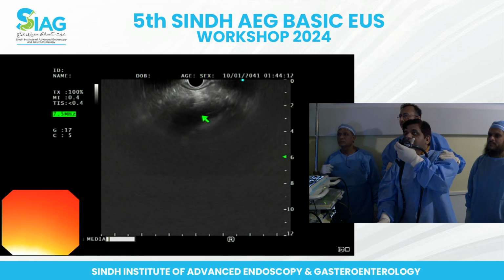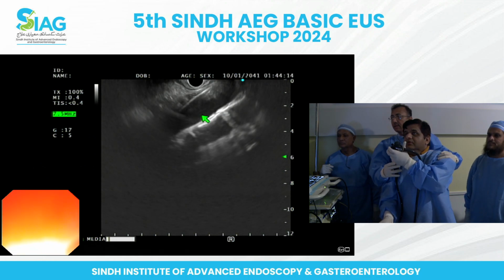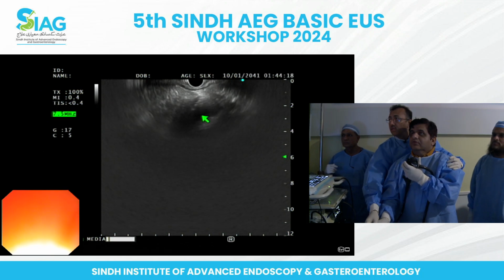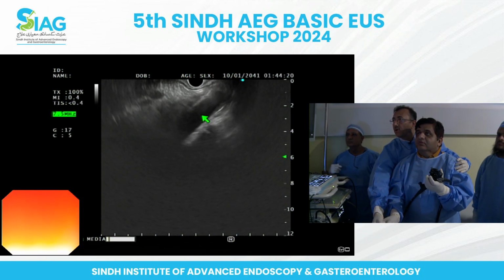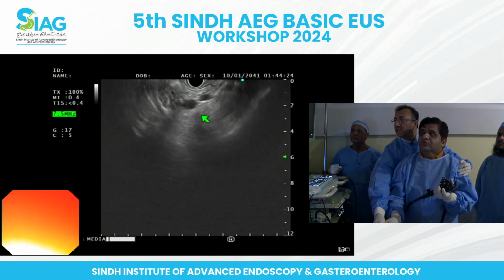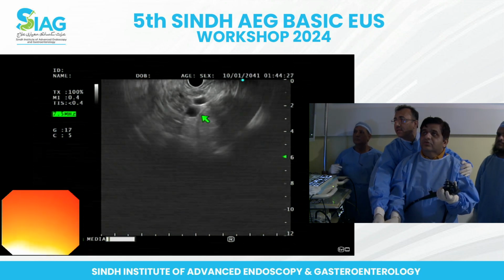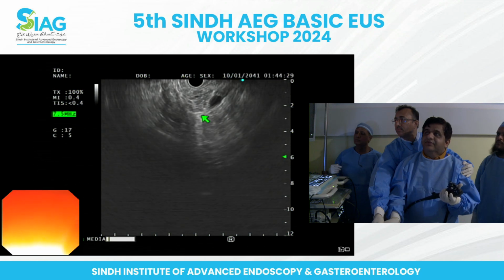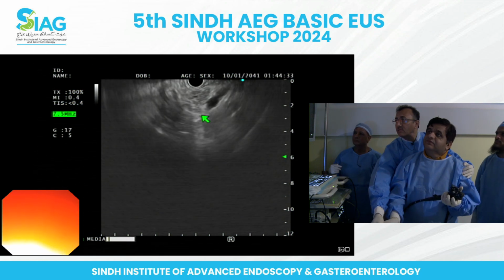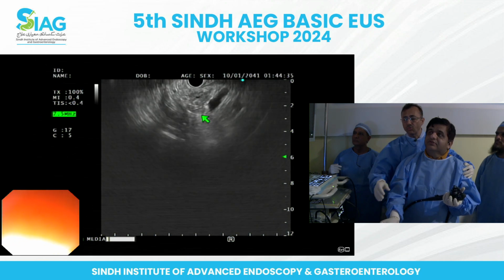So again you are at the liver, right, at the aorta. Now once you are at the aorta, slide, keep the aorta underneath, slight push, identify the celiac takeoff, and right there you are at the tail of the pancreas. So pancreatic duct right underneath your transducer. Now we want to go towards the head region.